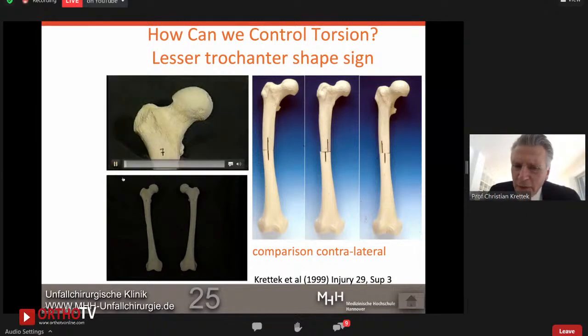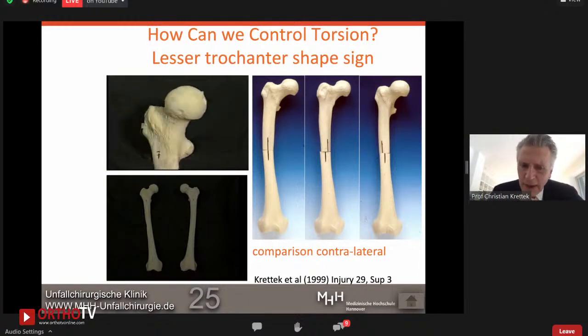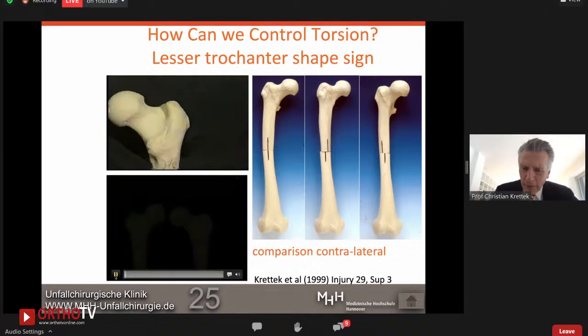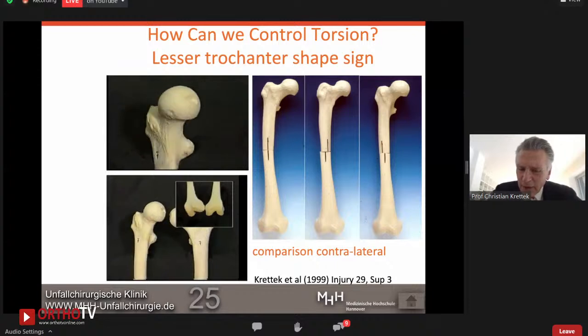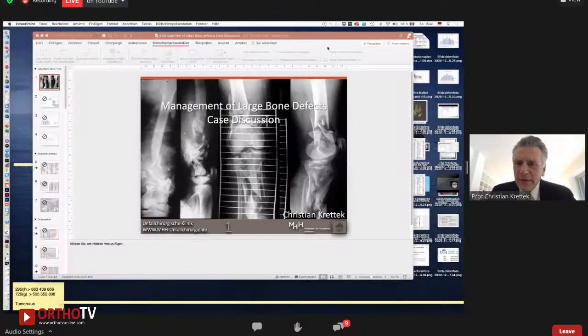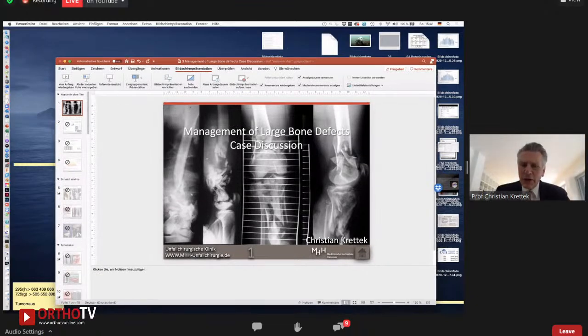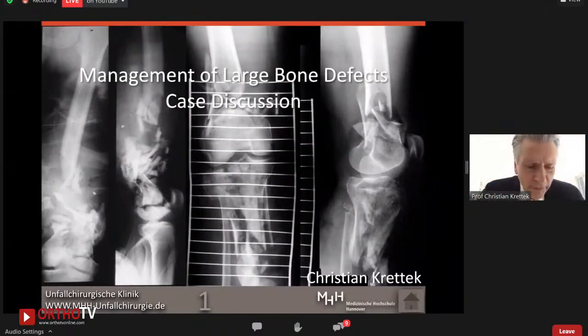And I have a little video as well. Look, small rotations due to the eccentric position of the lesser trochanter make a significant change in the profile. And here also in the lower part, you see the bilateral situations, small changes already enough to make the lesser troch disappear and reappear or be prominent. So that's the philosophy of the lesser trochanter shape sign. And I think there is also a paper from India which has shown that this is also in a clinical study a helpful tool for the assessment of torsional deformities.